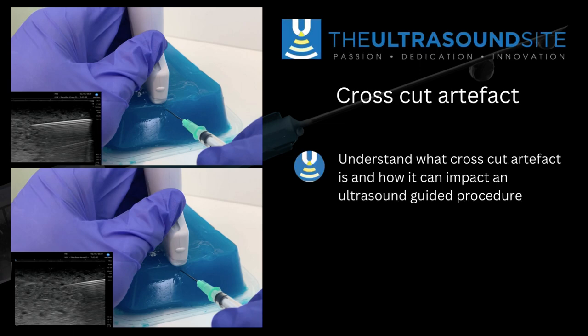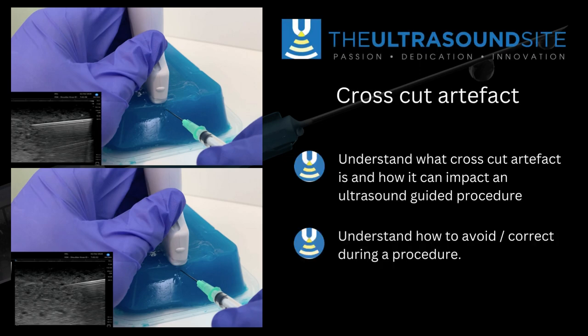Crosscut artefact is a potentially quite dangerous artefact of ultrasound-guided injections. You can see the top image here where the needle is very clearly visualised with the needle tip clearly seen, and in the bottom image the probe is oblique to the shaft of the needle, which gives an artificial appearance that you have the needle tip — but it's not; it's only about halfway down the shaft of the needle itself.